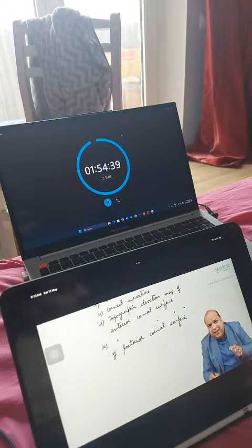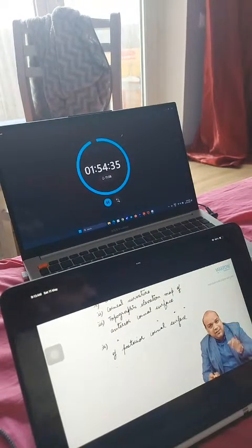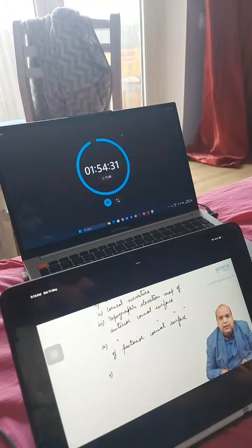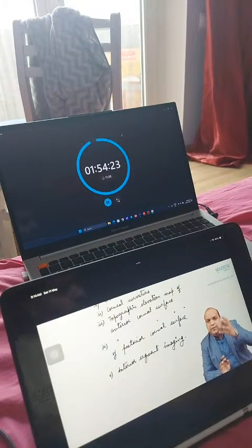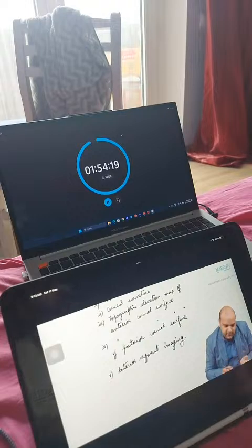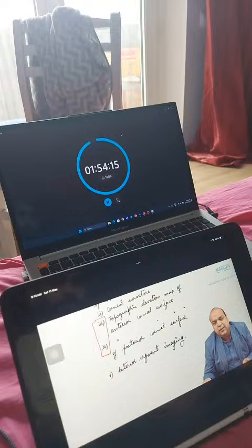So through the use of Pentacam, you will basically be able to see whether there is a problem in the anterior or the posterior surface. Any epithelial or endothelial problem, both you are able to know through the use of Pentacam. And lastly, it gives us anterior segment imaging also. You're able to see up to the iris if there is any problem from the cornea up to the iris also. Pentacam, 5 uses. Am I clear? But the main use is obviously the topography part. All the others are accessory uses of a Pentacam.